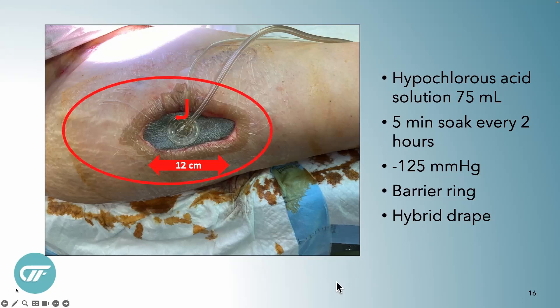Here are the settings for this patient: 75 milliliters of VOSH, a five-minute soak every two hours at negative 125. One of my coworkers, Angela, went to check on the patient the next day and called me asking why I had 75 milliliters going into this tiny wound. I was so proud that she picked up on that — I explained that we have foam way underneath, and then she said, 'Oh, that makes more sense.' Great catch on her part.